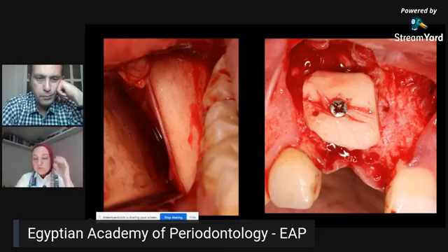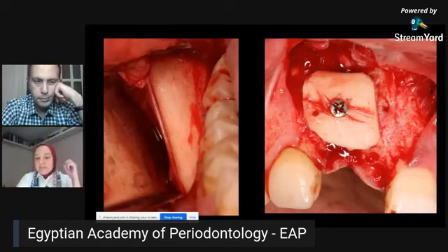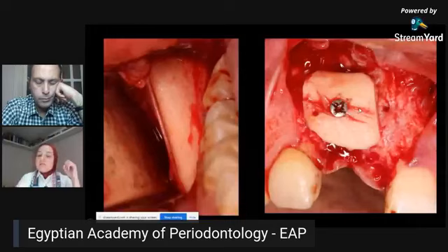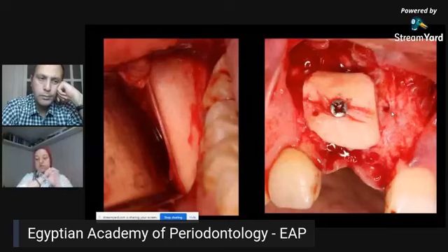And here I have a trick to share. I'm not an expert with blocks because I'm a periodontist, so I just did two or three cases for the knowledge of the technique. But here I would like to recommend something: when we do the drilling for this screw, it has to be a little bit wider than the size of the screw itself, so that the screw goes passively through the block and then penetrates the underlying autogenous bone. Because if the size of the drill is really the exact size of the screw, this block may fracture with the pressure of screwing it in. So this is really a very important tip.